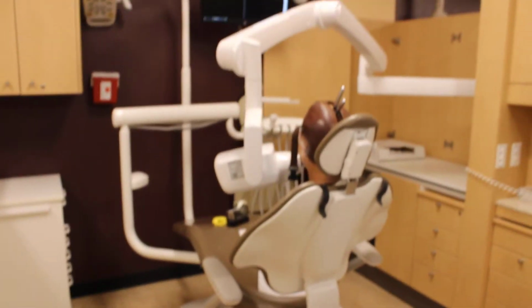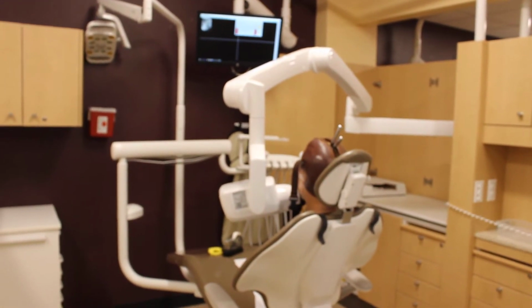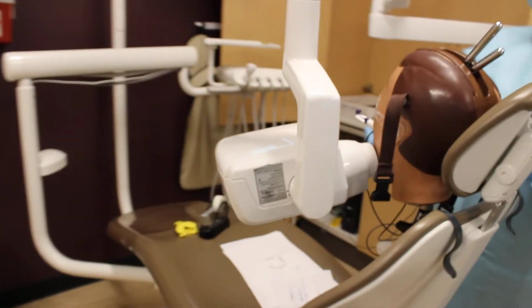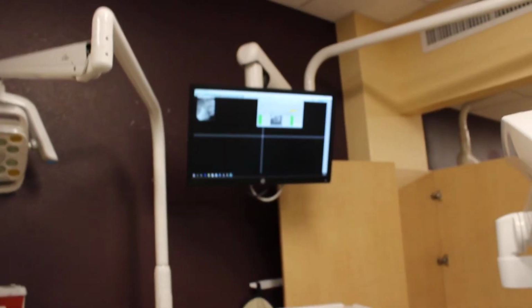Because I don't like to hurt people. And the XCP can be a little uncomfortable on people. Can you see that? Nice.